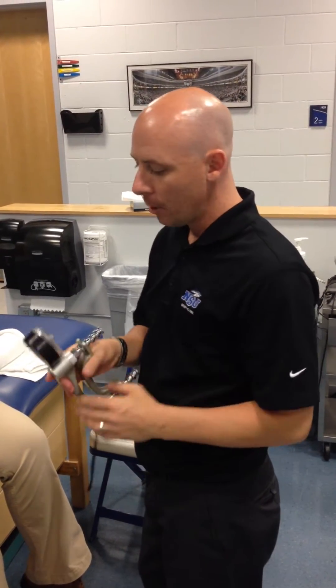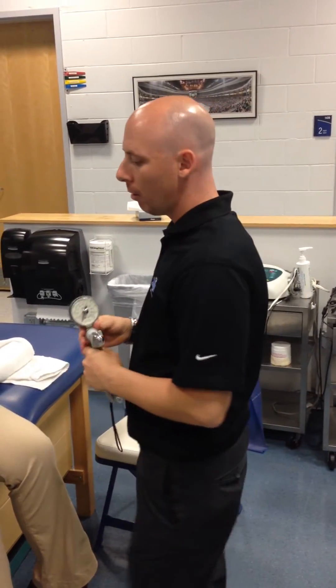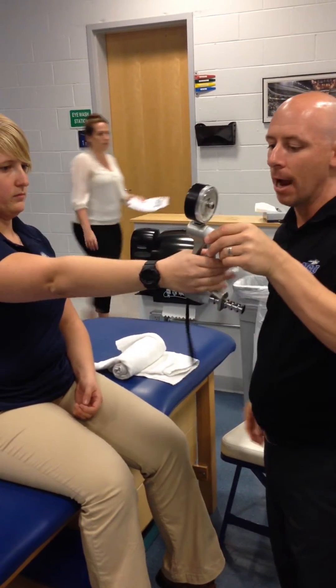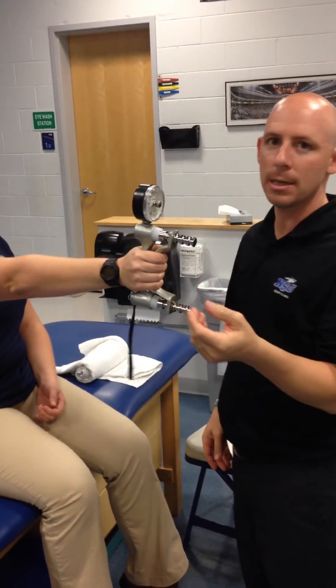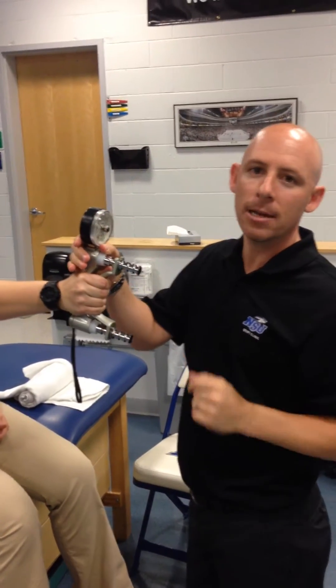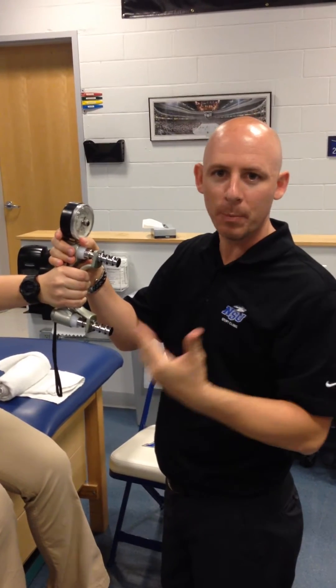We're going to demonstrate mobilization with movement for lateral epicondylalgia. We have a dynamometer. What we're going to do is have her reach her right arm straight — it needs to be straight. We're going to have her grab the dynamometer and squeeze it. I tell them to squeeze as hard as they can, then I take a reading of the dynamometer. Let's say in this case she only had 20 pounds and it was painful.